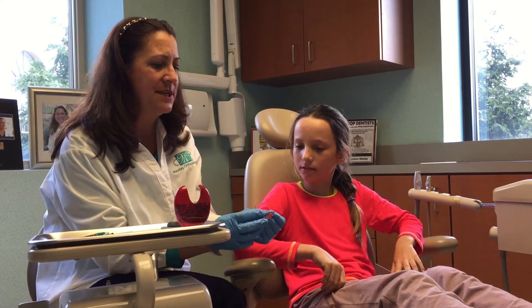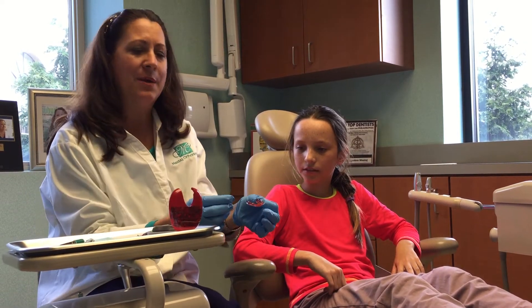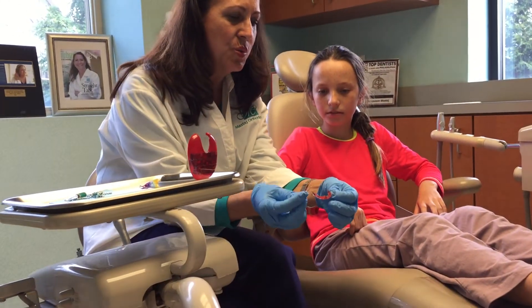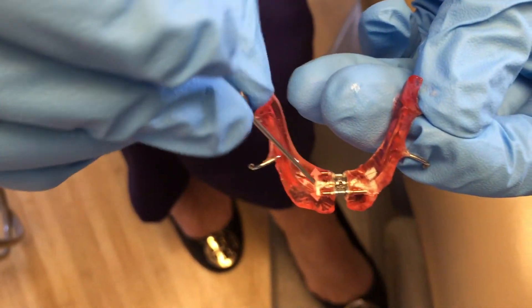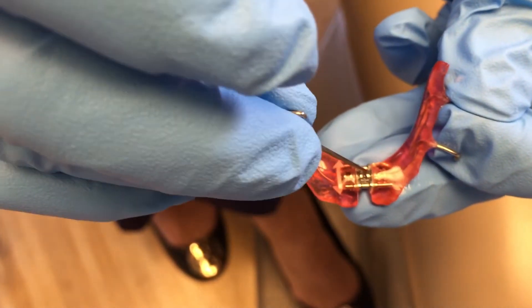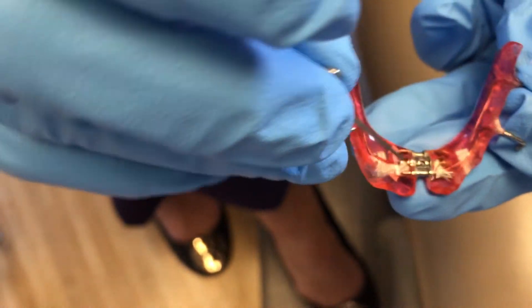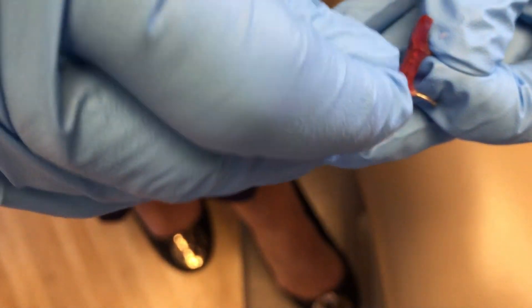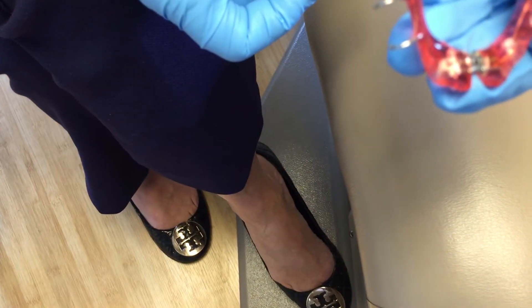This is also a type of expander, and what we're going to do is show you how to turn the expander today. The Schwartz is made out of acrylic and wires, and there's a little hyrax screw. This little key goes into the expander, and you follow the arrow — it's so easy. Even Zoe can do her own expansion. So once the key is in, you turn straight down, and that expands the hyrax. Why don't you show us how to do it?